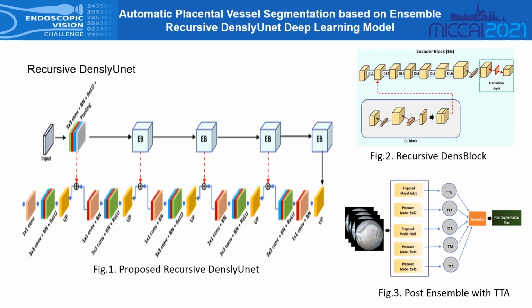We also use some test time augmentation method before ensembling, and that produced a little better performance. The flipping and rotation with different angles are used as test time augmentation that produce better performance. With the test time augmentation and ensembling, the prediction of each cross-validation model with different training and validation samples, the proposed approach may provide the better and optimal solution for this semantic segmentation.